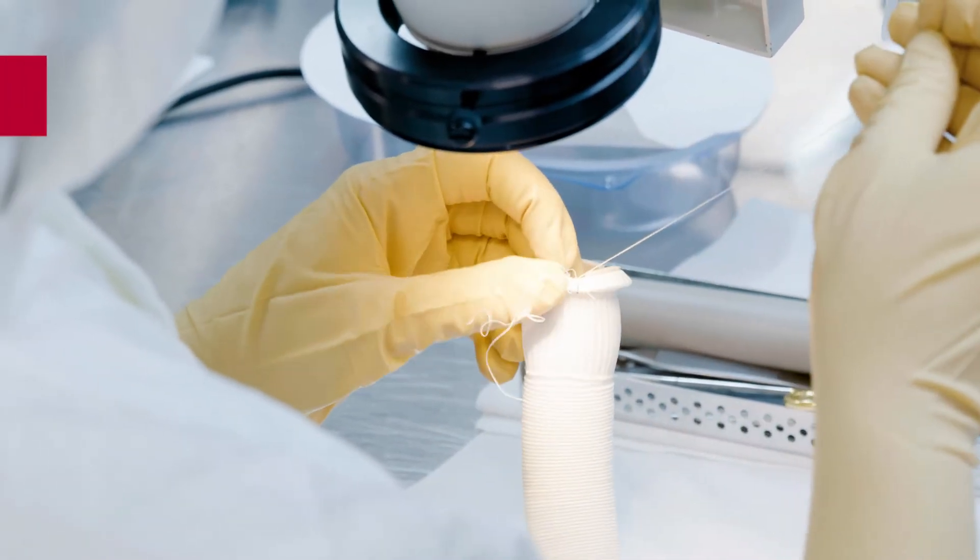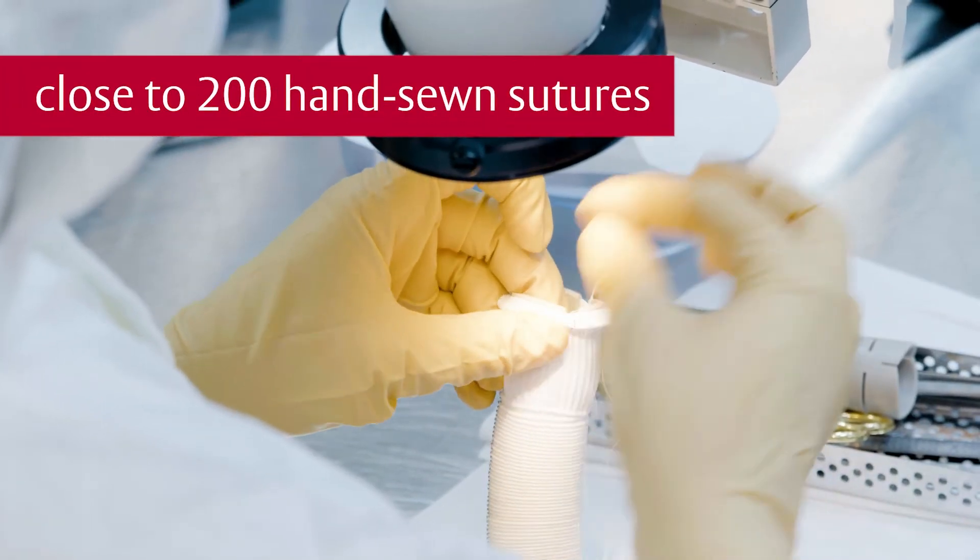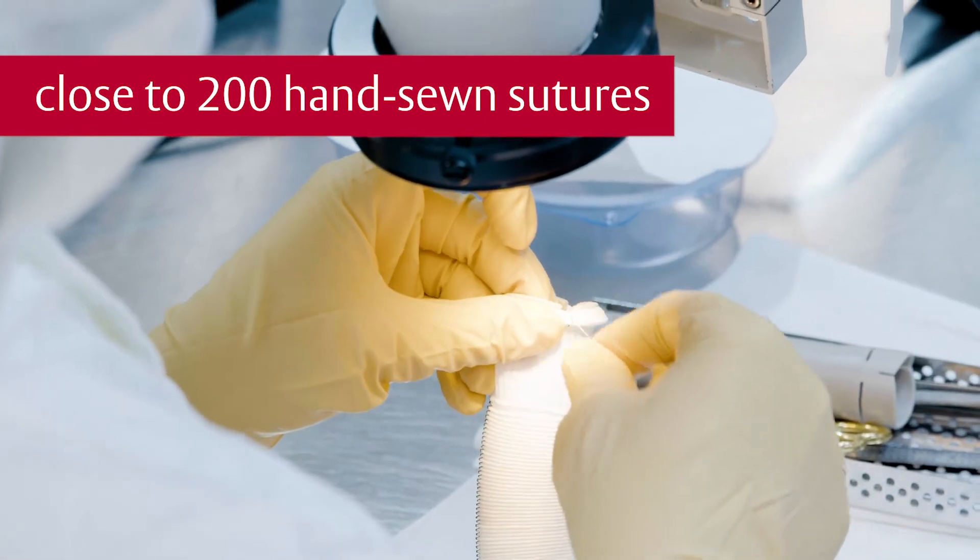Once the valve portion is assembled, it then undergoes multiple functionality tests to ensure proper performance of the valve. The graft to sewing ring attachment is done with close to 200 hand-sewn sutures depending on size. This allows for secure hemostatic connection between the graft and the valve.